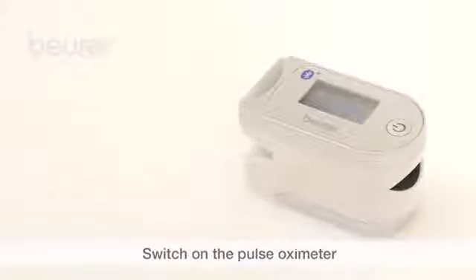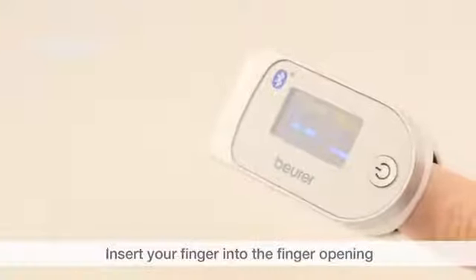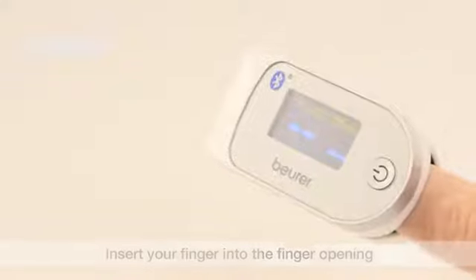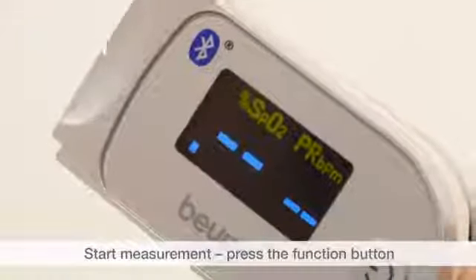Switch on the device by pressing and holding down the function button. To take a measurement, insert your finger into the finger opening of the Pulse Oximeter. Hold your finger steady, then press the function button and the measurement will start.